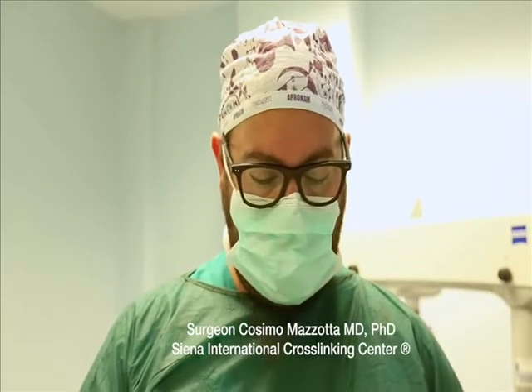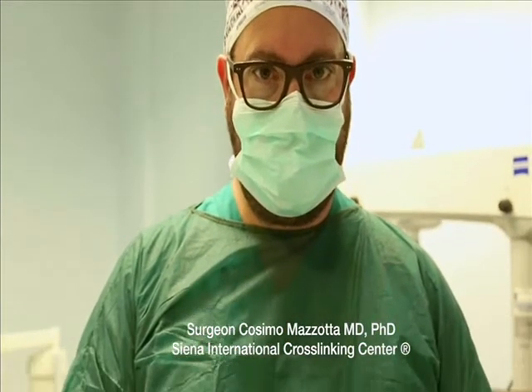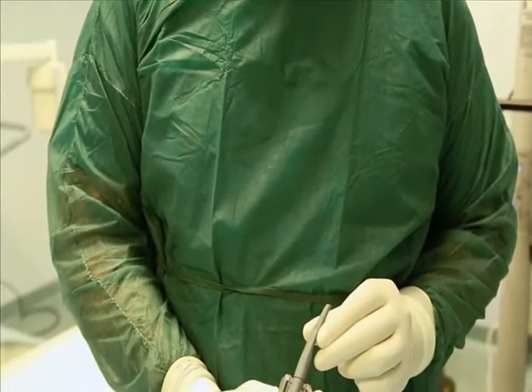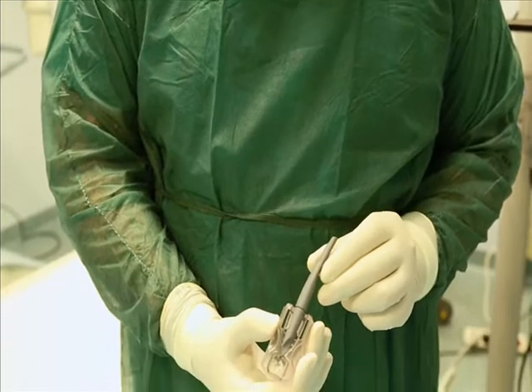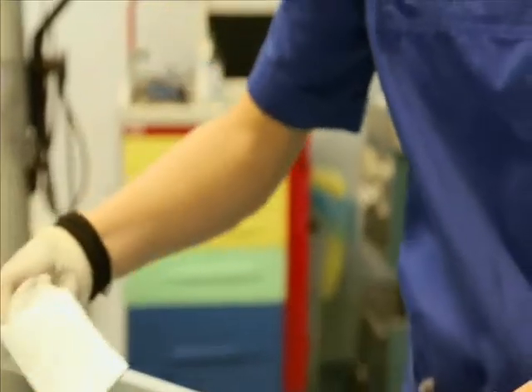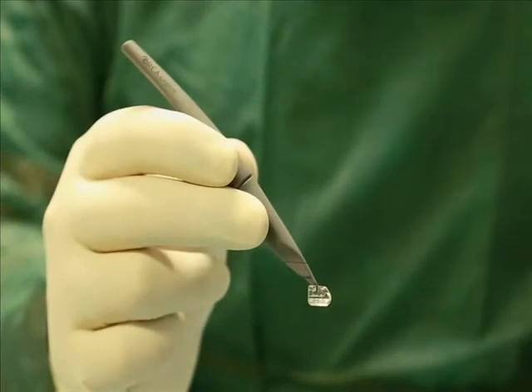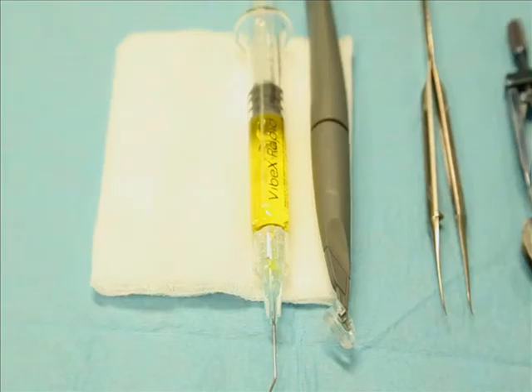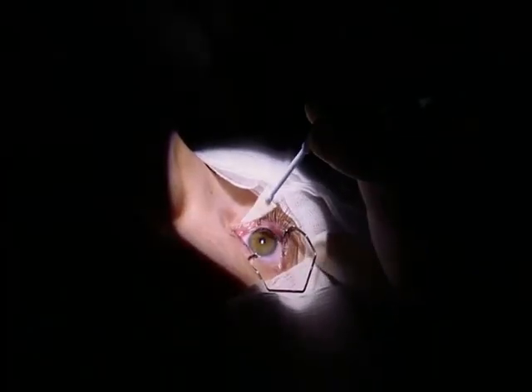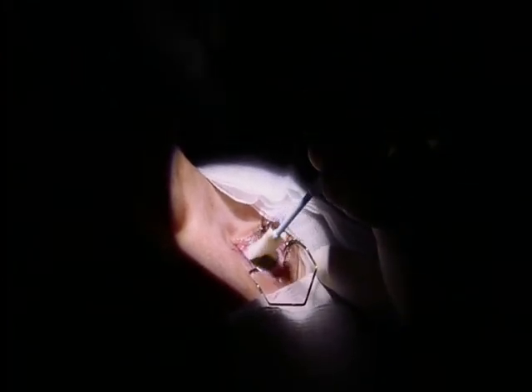Today we are using the EBK instrument from Orca Surgical for safe epithelial removal without damaging the Bowman's membrane, for corneal collagen crosslinking. The goal is to remove the corneal epithelium safely without damaging the basal epithelial membrane and Bowman's lamina. It is necessary to dry the surface.